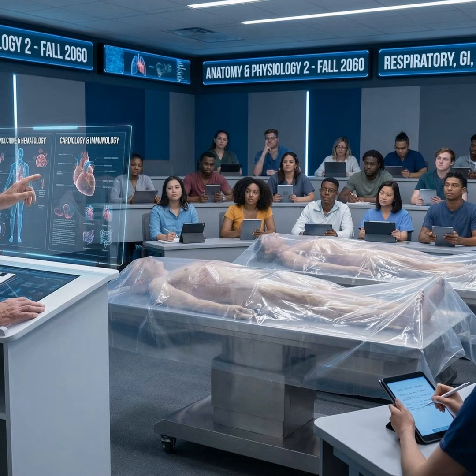That's our final clue. So in this case, a restrictive pattern plus a low DLCO tells us the problem is inside the lung tissue itself. It's making it hard for gas to diffuse. And that is the absolute hallmark of an interstitial lung disease, like pulmonary fibrosis.